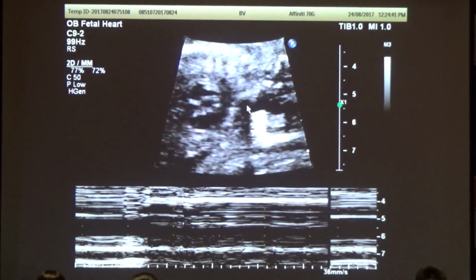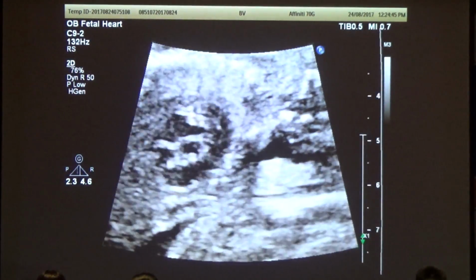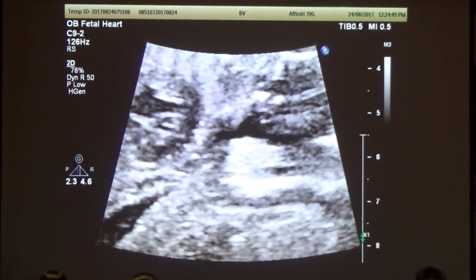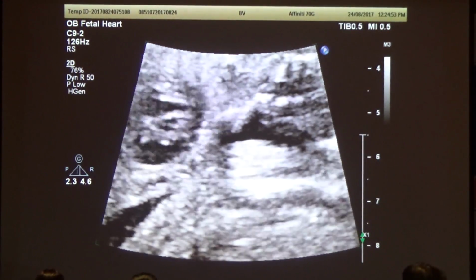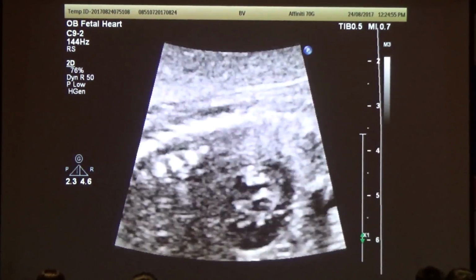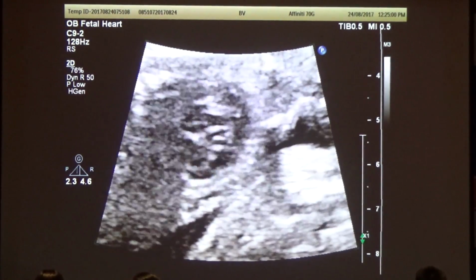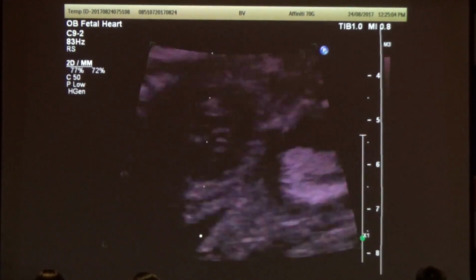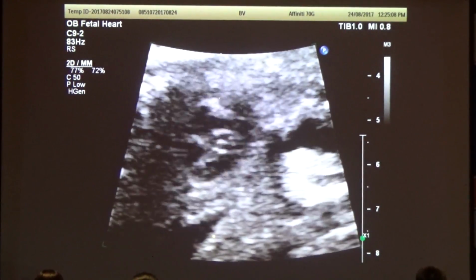Okay, now, if that's really the case, the M mode is this here? Yeah. Okay, now I want to see the scan. How do I change the scan? Where's the little dots? No, I don't want to do that. I just want the M mode cursor. Yes, please. Okay, now we put this right there. Now let's get an M mode.